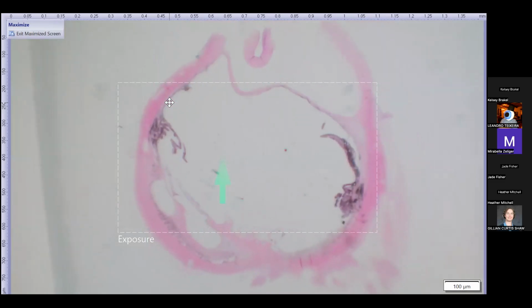So here's what our initial section was like. Again, we have this area where we can follow the sclera around, and then there's this more disorganized pink tissue, so fibrosis, that bridges this gap where the sclera slightly curls inward, and it also extends into the globe. And again, we still, at this magnification, can't really make out much evidence of a lens, but let's see what we see when we get closer. The optic nerve is not well sampled, kind of tough to catch it in a case like this with a posterior rupture site right nearby.